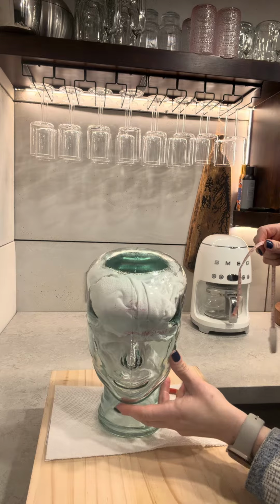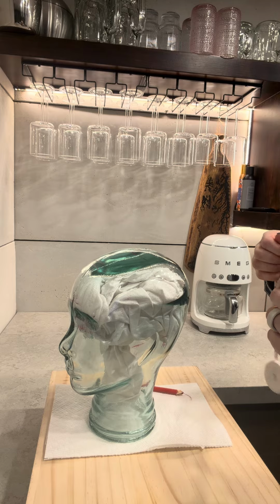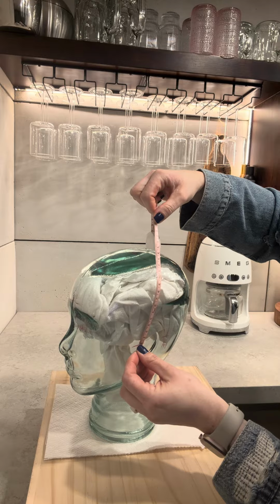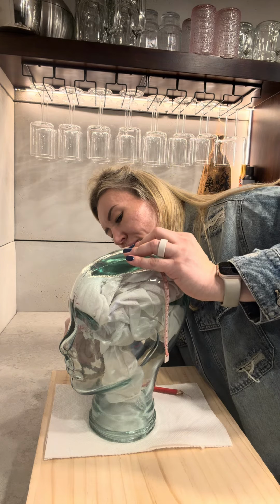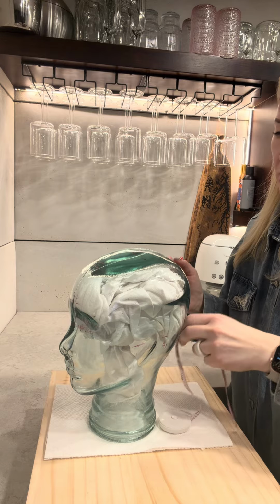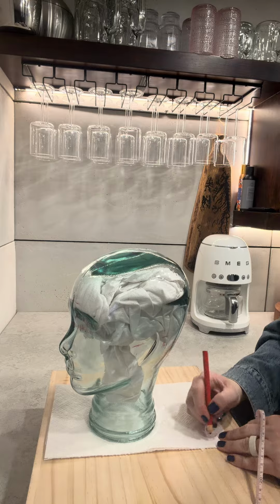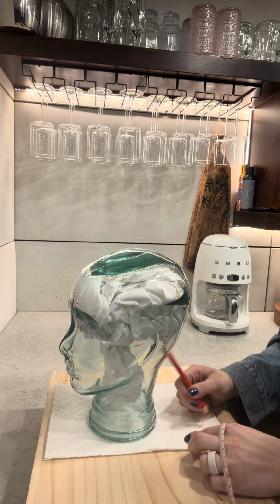Now I'm gonna do the preauricular measurement from left through Cz to A2. It's 36. Okay. 36. Divided by 2.